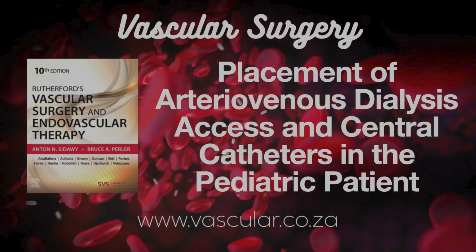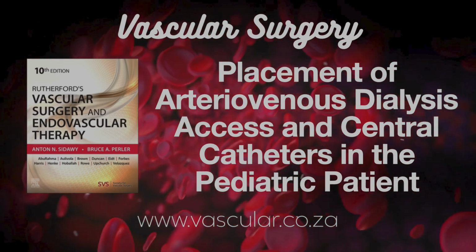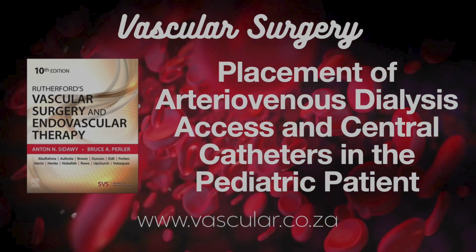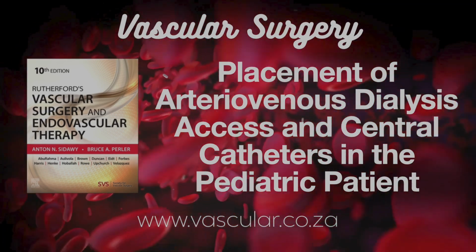And getting the right shape is also a challenge. Pre-curved catheters usually only come in larger sizes. So for smaller kids, the surgeon often has to create the curve themselves during placement, which might need an extra little incision. Okay, now let's switch gears fully to arteriovenous access, fistulas and grafts.